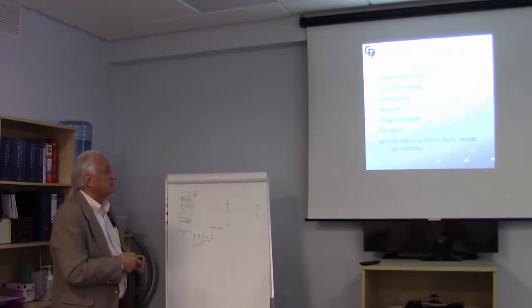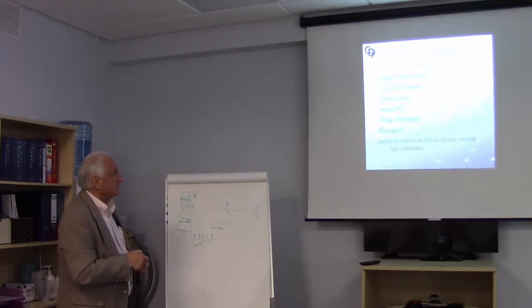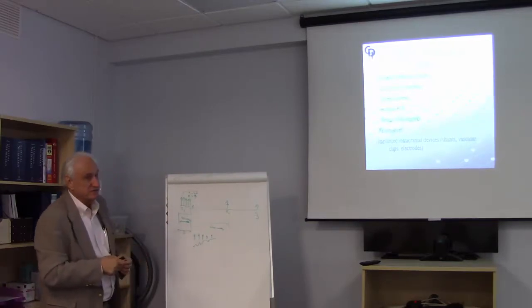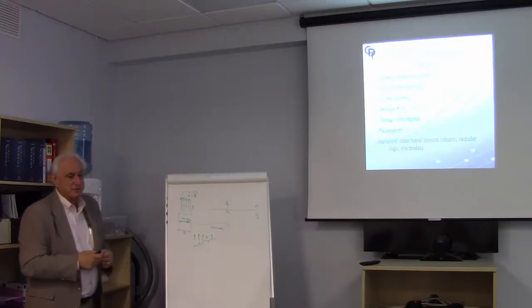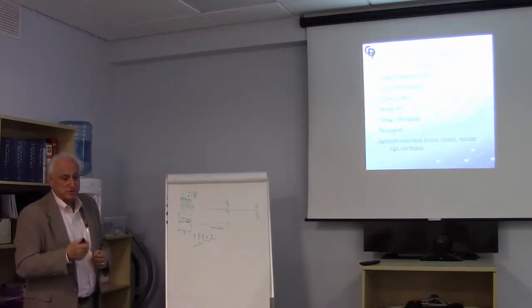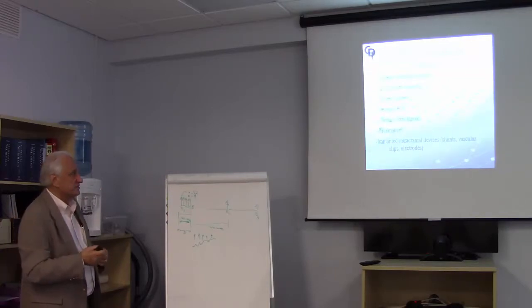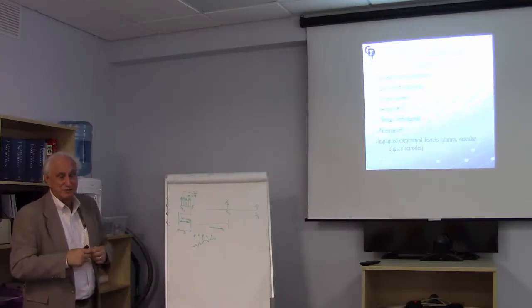We talked about contraindications. Epilepsy and seizure disorders are a contraindication. I personally have never seen a patient who has had a seizure disorder be put into seizures by transcranial motor potentials, and I think I've seen one report in the literature, which I think was kind of suspect. The idea there is that you're going to cause kindling.